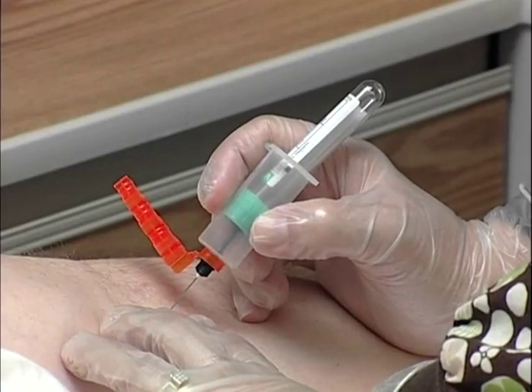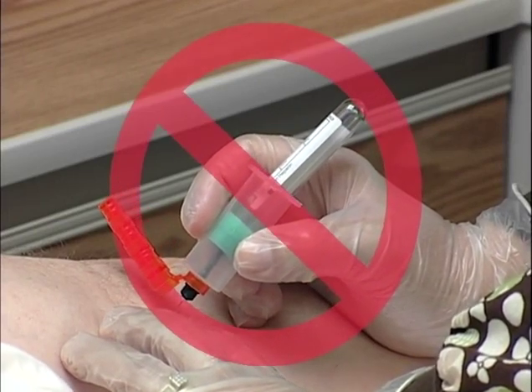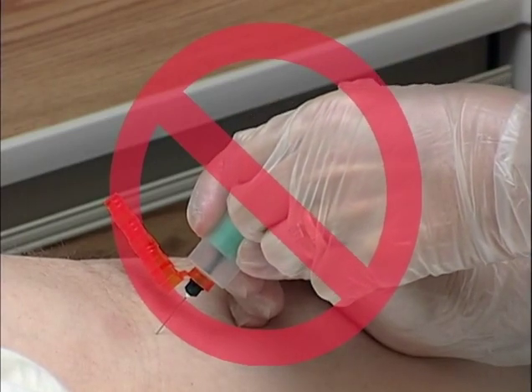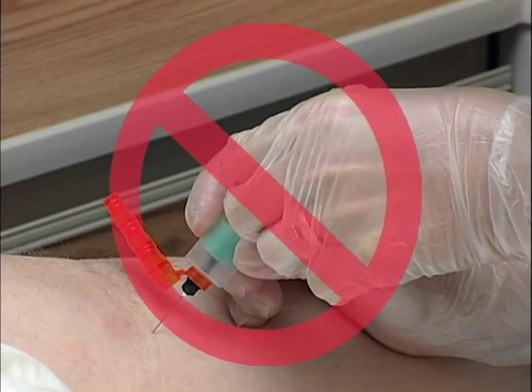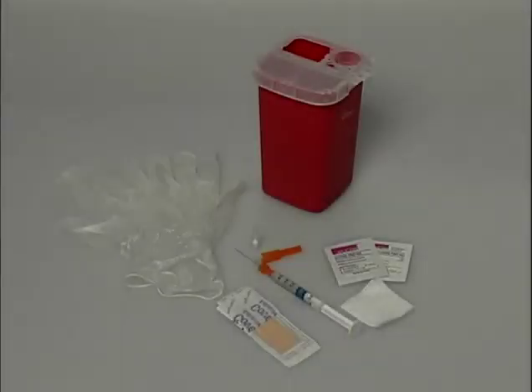Arterial blood for blood gas analysis should not be drawn with excessive aspiration because subatmospheric pressure may alter test results. Therefore, drawing into evacuated tubes may not be appropriate. Other supplies include alcohol preps, gauze, bandages, a sharps container, and gloves, preferably latex-free.